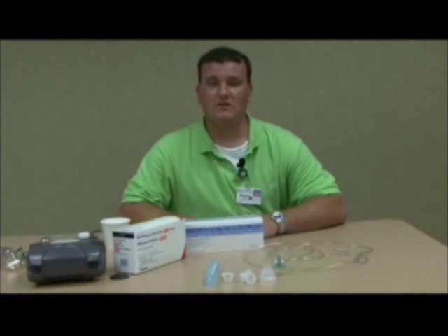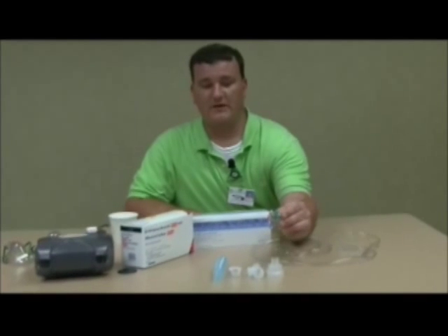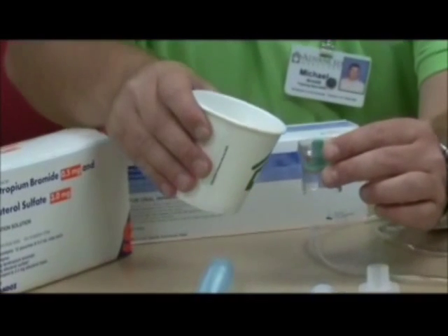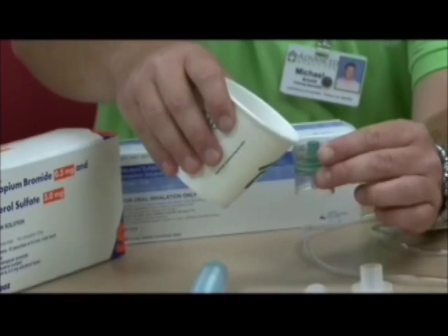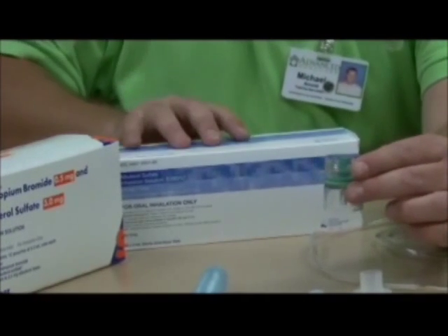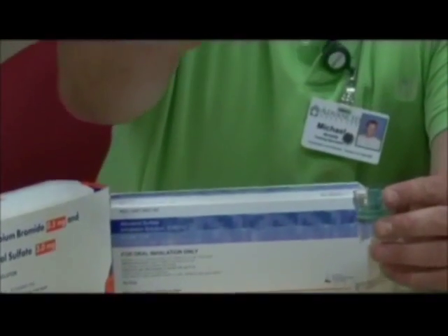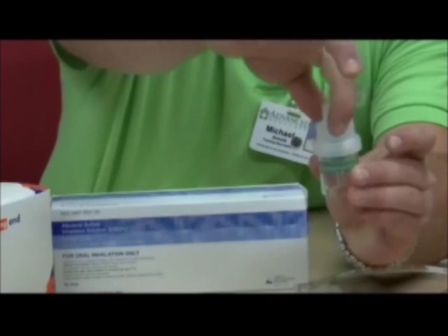Step two: inserting your medication into the nebulizer kit. First, you will need to grab your medication cup. I'm going to use water for demonstration purposes right now. So you would insert your medication in through here. Your medication will come in boxes such as the ones on the table here. Next, I'm going to take the nebulizer medication cup lid and screw this on.